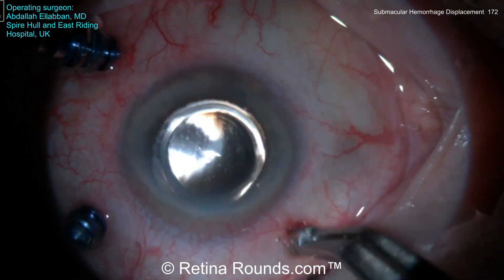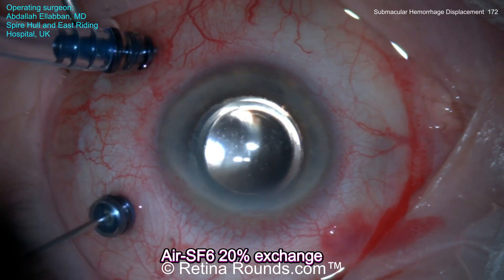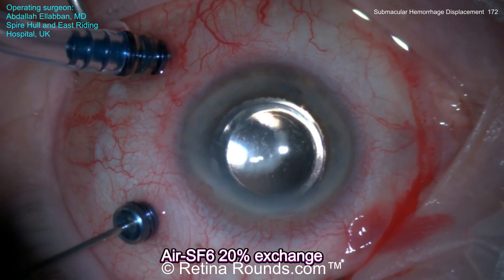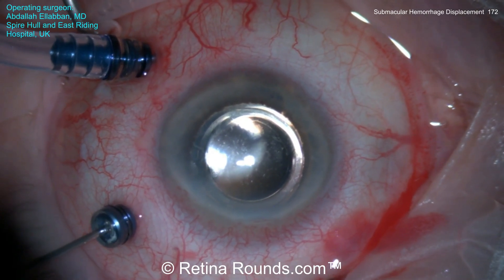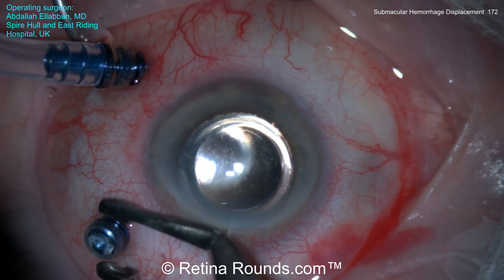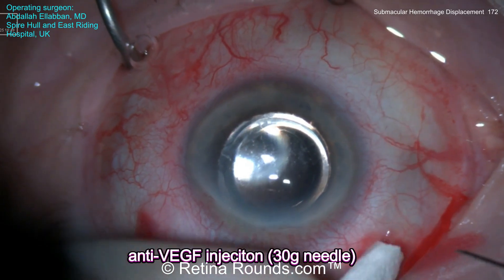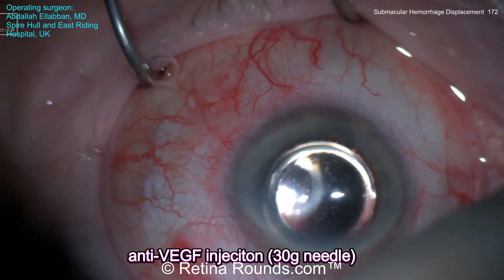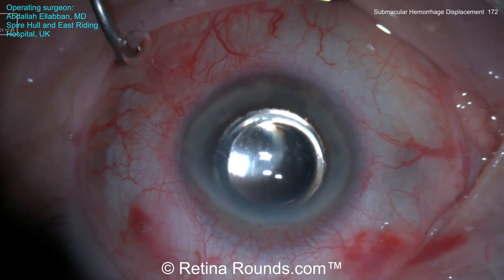Once that's done, the trocars can be removed, and the residual air bubble in the vitreous cavity is exchanged for a non-expansile concentration of SF6 gas. Some surgeons prefer a shorter-acting gas bubble, while others prefer just leaving the eye air-filled — it's up to the surgeon's preference. Once the air-gas exchange has been performed and the trocars are removed, Dr. El-Aban injects some anti-VEGF medication into the vitreous cavity via a 30-gauge needle. Another option would be to inject the anti-VEGF medication along with the TPA into the submacular space.